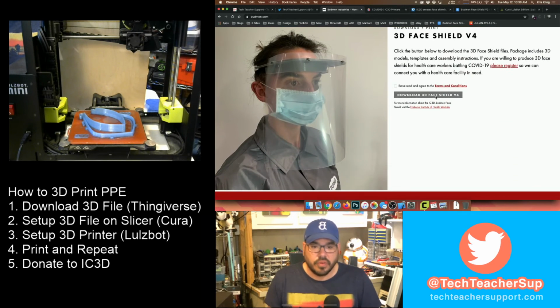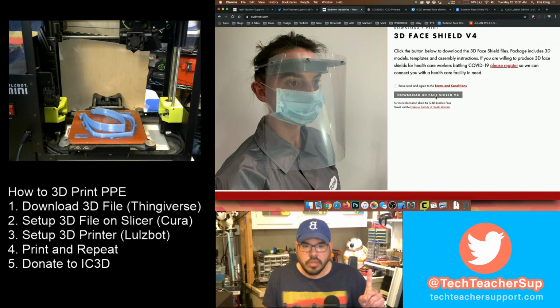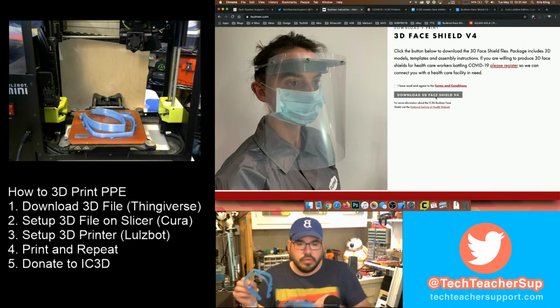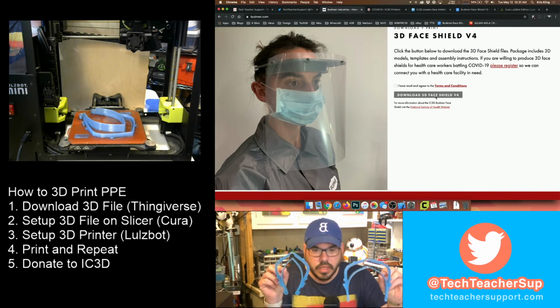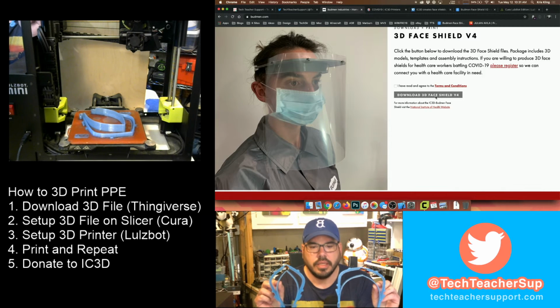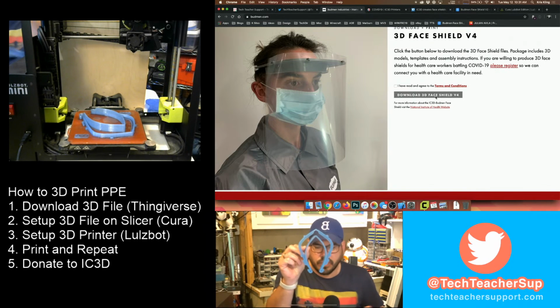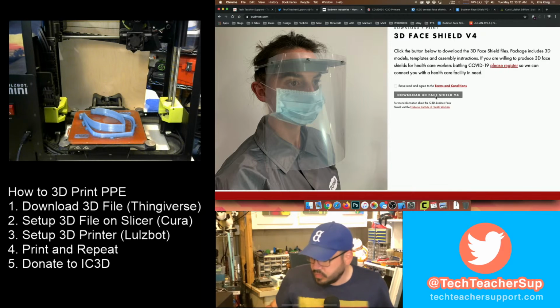So I was kind of bummed for a few weeks until someone on Thingiverse made the version you see over here on our 3D printer, which is slightly folded so it can fit. And then when it gets assembled, it gets unfolded and put on. So here's 2 of those. This is the folded version, and this is one I've unfolded. And this is really cool. We're going to go to the website right now and see the person who designed this folded version. We're going to download that and print one of those.